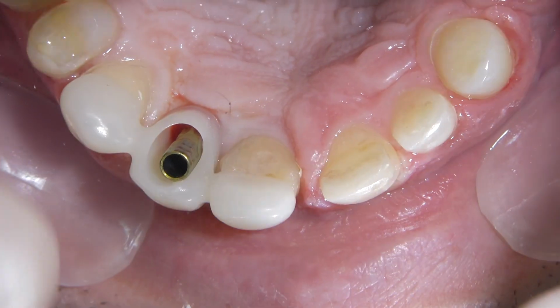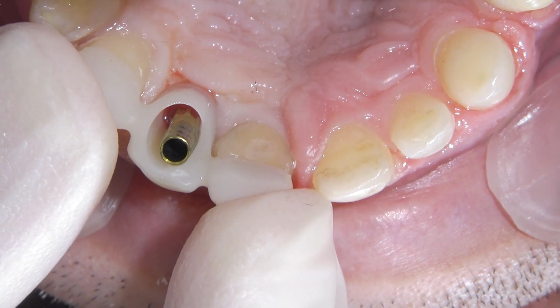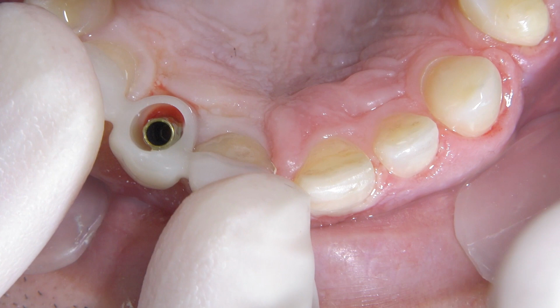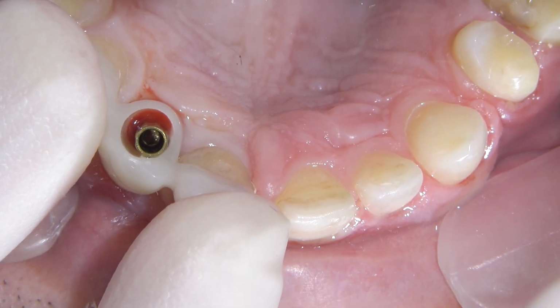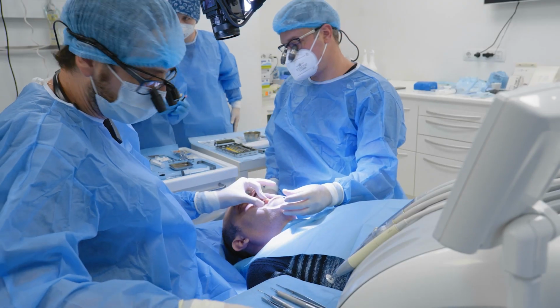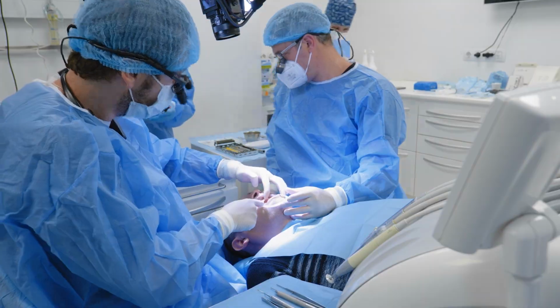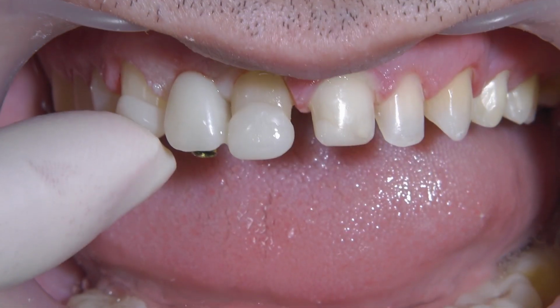I have space, and I asked the lab for the space that you see here, you see? So I can use flowable composite here to capture this position, right? The wings will give me exactly the position, you see? Let's just take some flowable composite and connect everything.